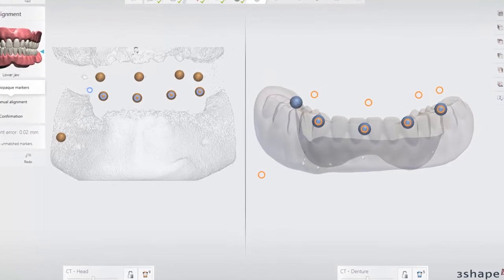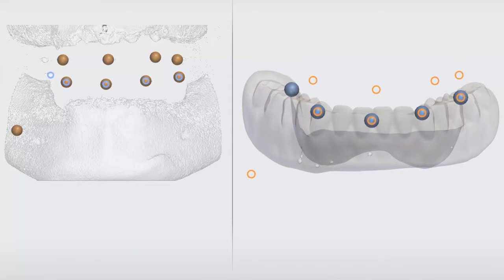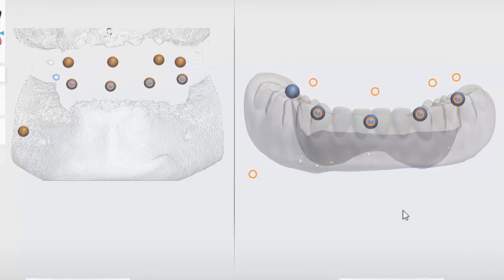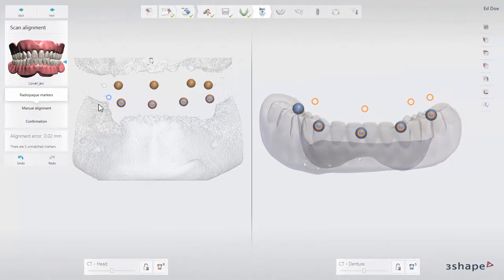Here you will see the two CT scans with the radio opaque markers. The initial detection of the radio opaque markers is done automatically by the software. Keep in mind that the same number of markers should be detected on both scans and their position should coincide.